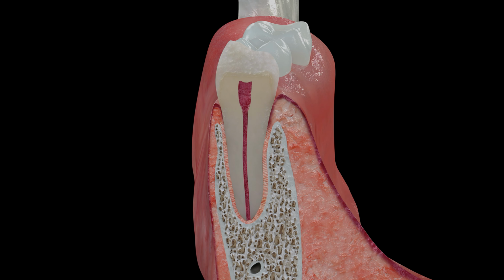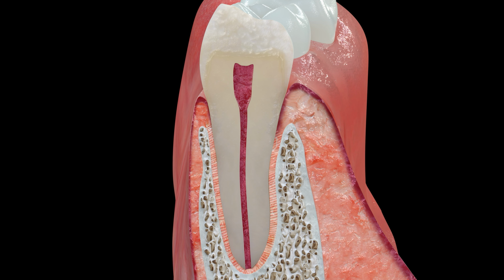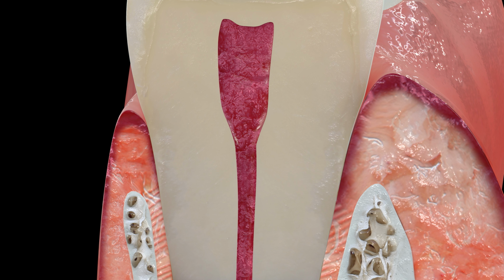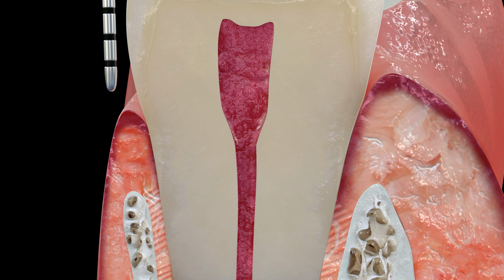This is the anatomy of healthy gingiva, where the sulcus depth typically ranges between 0 to 3 millimeters, and there is no loss of attachment, highlighting the connective tissue attachment level at the CEJ and epithelial adhesion. In this example, probing depth of 2 to 3 millimeters, absence of inflammation, and no attachment loss signifies healthy periodontium.